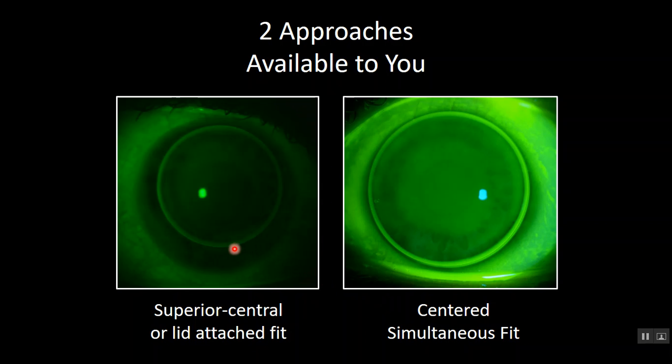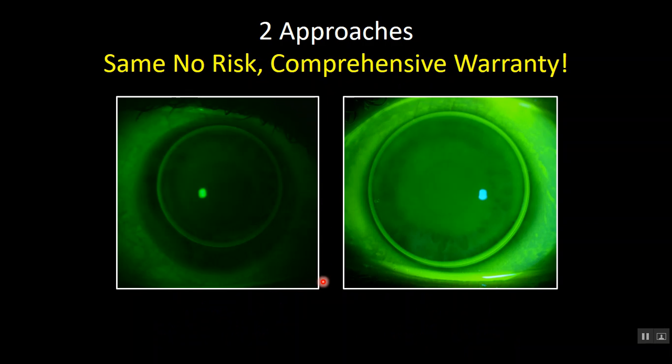The small diameter essential-like lenses come out of an era of fitting 9.2 and 9.5 lenses back in the 80s and early 90s. Fitting has evolved. Large diameter lenses have taught us that we can create better comfort for patients, better centration of the optics, better visual outcomes as well.